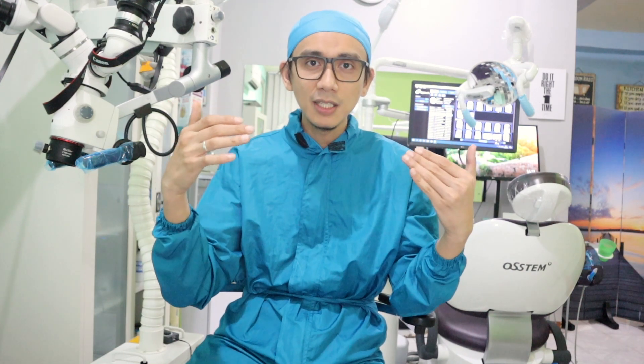The challenge of doing this case was how to place rubber dam in this particular tooth very quickly during the protocol, and then how to do an endodontic treatment within a limited frame of time. Because, as you know, a child is having some problems in accepting dental treatment, particularly under rubber dam isolation.